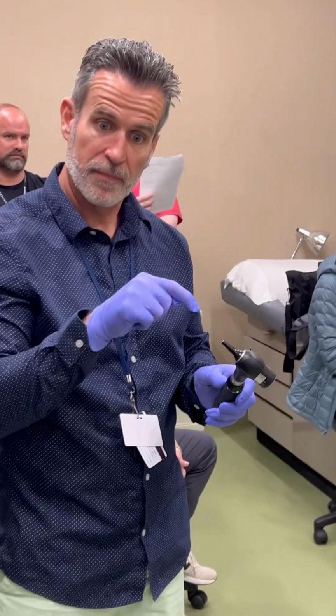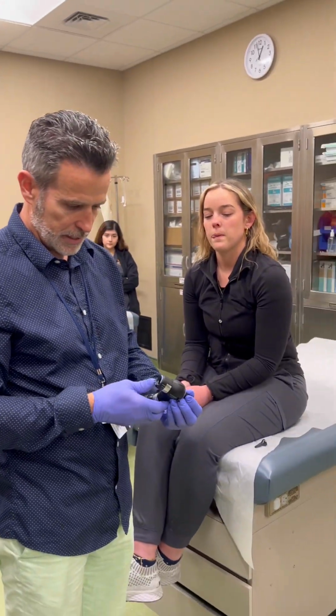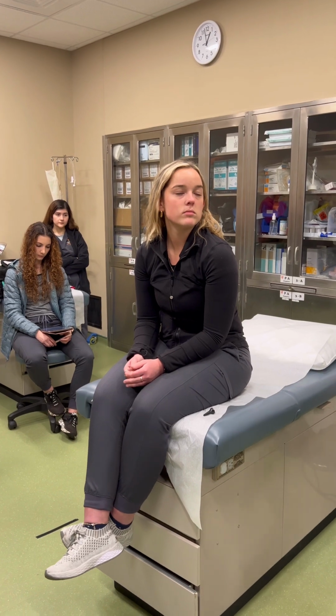That's what you need to do. And by holding her breath, guess what that does? Keeps the lens from fogging up. Exactly. So, I've got to remember how to detach this. All right. Next. Sinus.